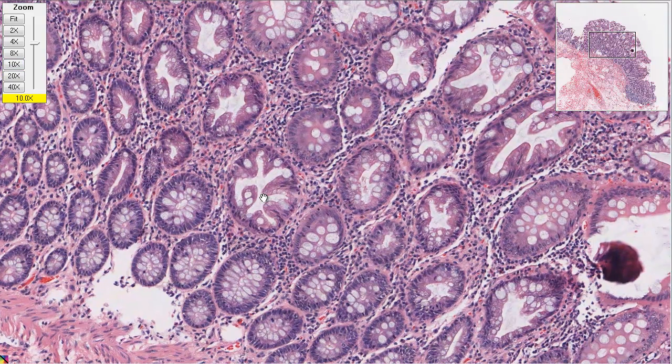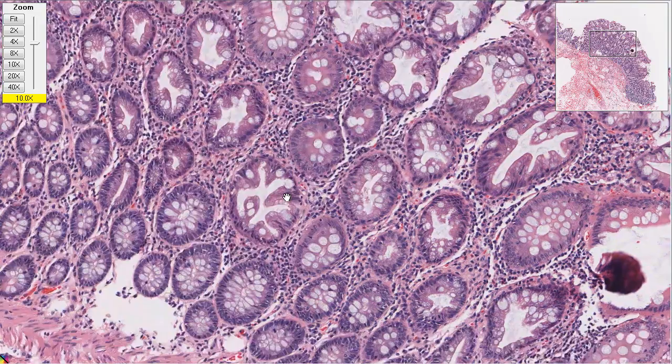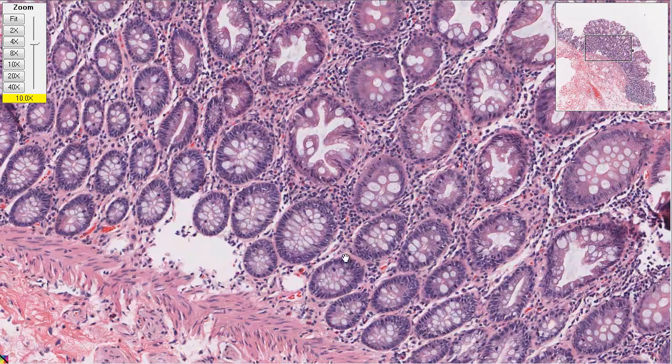So here we would sign this off as hyperplasia. Hyperplasia — hyper, like too much of something, and plasia means growth. So hyperplasia means too much growth. But the important thing is if you took away the irritant, it wouldn't do this. So if you took away whatever the irritant is for the hyperplasia, it would go back to being normal.